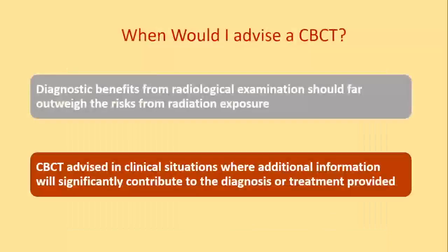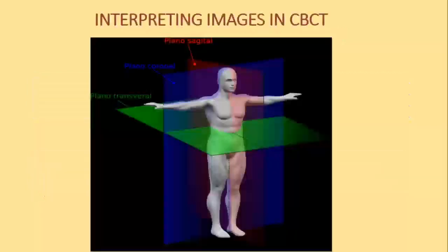Fine. When would I advise a CBCT? Mainly, very important, you all should know, you should have some diagnostic benefit. Just because there's a machine around, you will not be advising CBCTs. And when you advise CBCT, you should ensure that your clinical diagnosis is not enough. You need that extra adjunct to come in, and then you would ask for a CBCT.